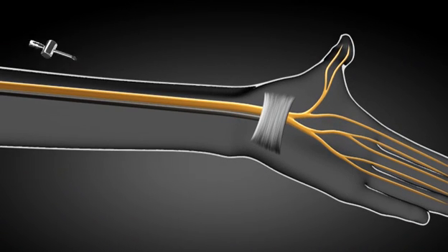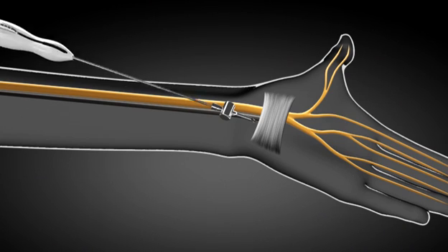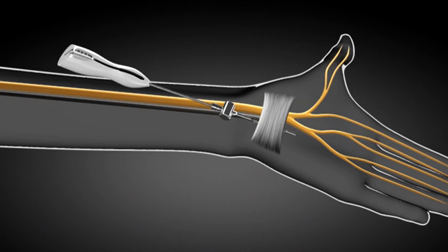Next, the access cannula assembly is advanced into the entry point and the stylet is removed. The Manos carpal tunnel release blade assembly should then be inserted into the access cannula and directed towards the palmar exit point.